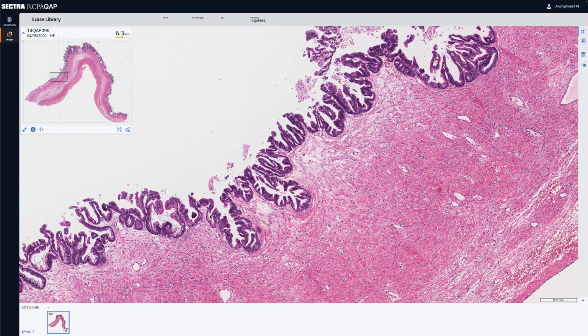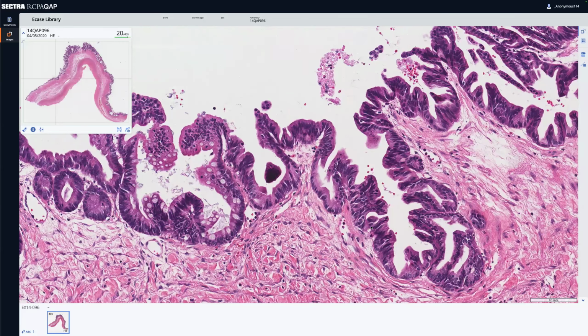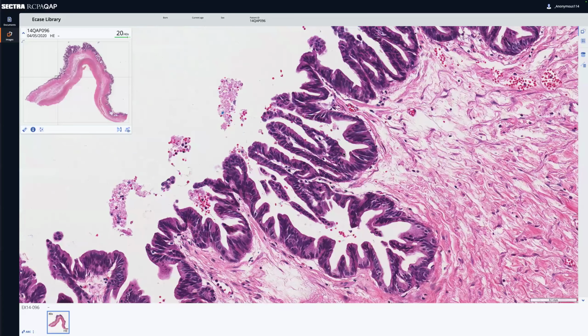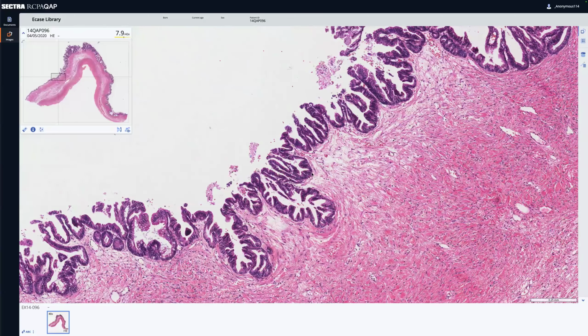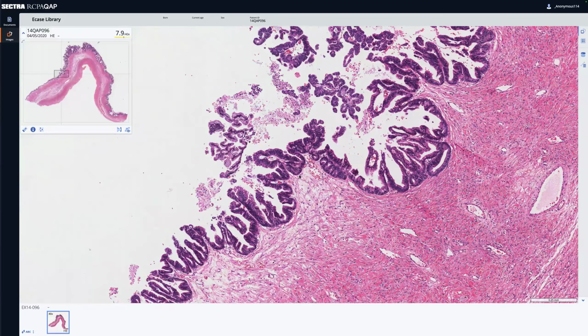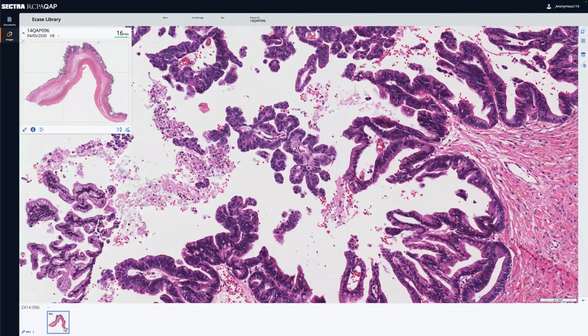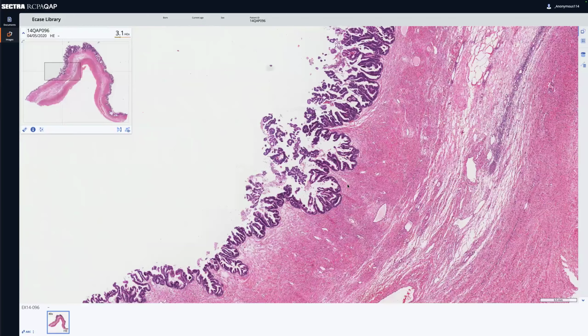Okay, so most of these, you would look at those nuclei and say, yeah, those are kind of adenoma grade if you were looking at the bowel. If you had an adenoma with this in it, you would be fine. But carcinoma in situ here in these ovaries, the nuclei get up to grade 3. So the first adverse prognostic feature is that there is grade 3 nuclei, and there's no grade 3 nuclei here. So we've got a mucinous borderline tumor with no invasion.